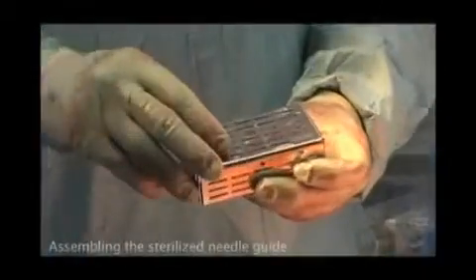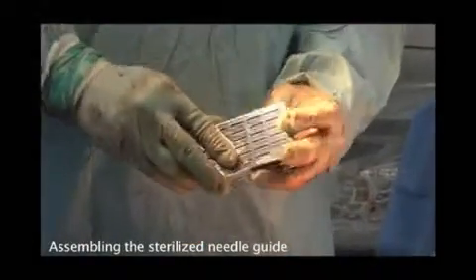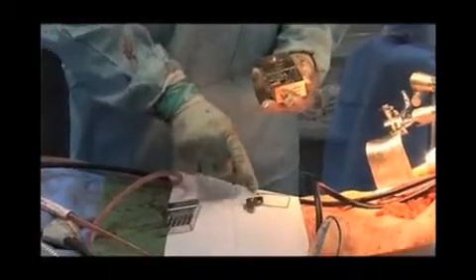Directly from the central sterilization department we receive the small box here. That is containing the devices which we need for this steering. As we can see, there is 3 channels which we are going to select between for which angle we perform the puncture under. So this is the devices which we need, and then we will have to assemble it.